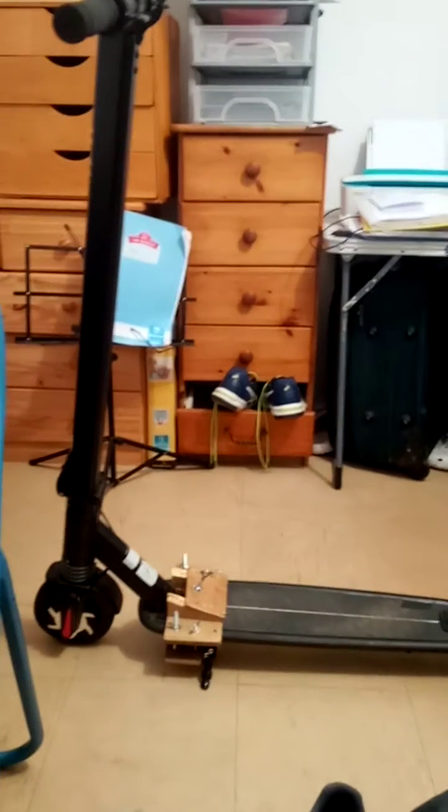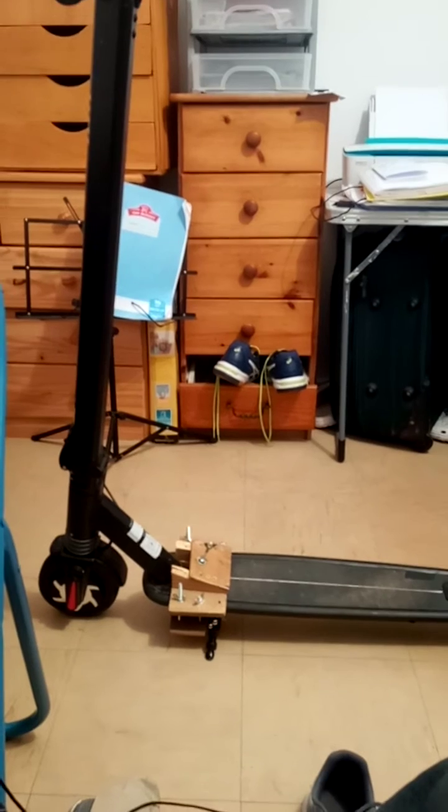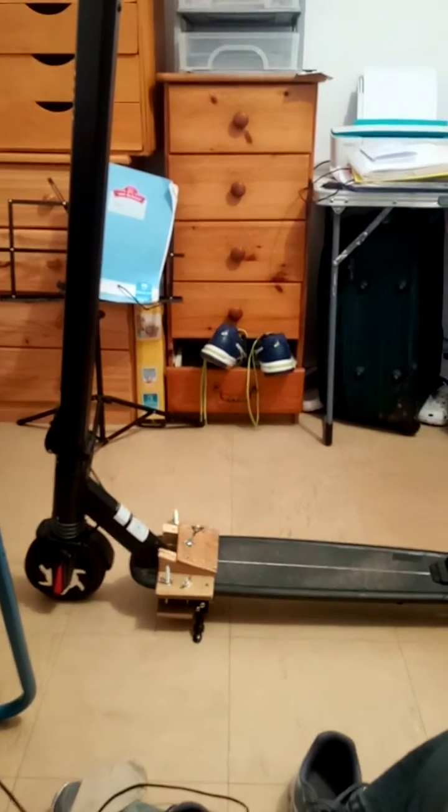This is just going to be a quick video showing my electric scooter and wheelchair combination. This is the little jig that I made for the scooter.